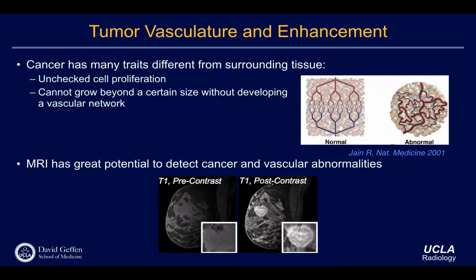This is an example of MR with the contrast injection. This one is called T1 pre-contrast. Without the contrast agent injection, if you just have a T1 weighted image, you don't see any differences. Whereas with a T1 post-contrast, meaning you inject the contrast agent, wait a certain amount of time, and then acquire a T1 weighted image, because of the difference in T1 relaxation, you're going to have a brighter signal in the tumor area and a little bit darker signal in the normal area.